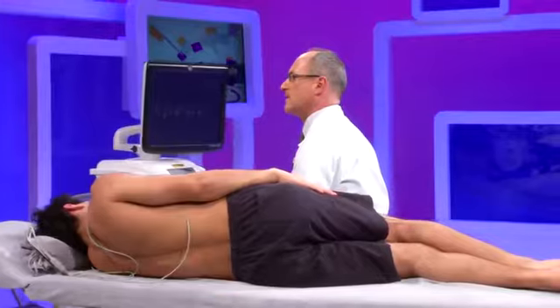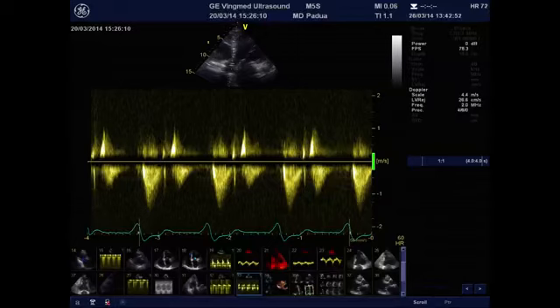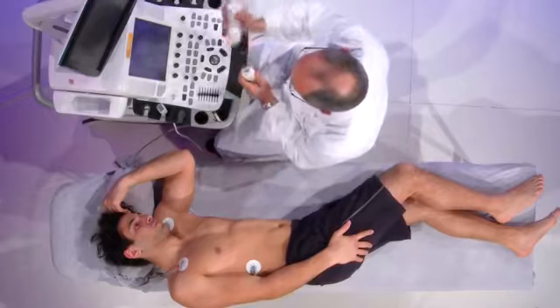So one of the questions is the origin of the tricuspid regurgitation. This is not a main issue in this patient because the tricuspid regurgitation was really mild, but sometimes you have a moderate or also severe regurgitation, and you are wondering what is the cause. If there is no trauma on the tricuspid valve due to biopsies or other issues related to the surgery, one of the causes may be the interference of the pacemaker catheter with the tricuspid leaflets. And this is something that you can easily check with your 3D scanner.